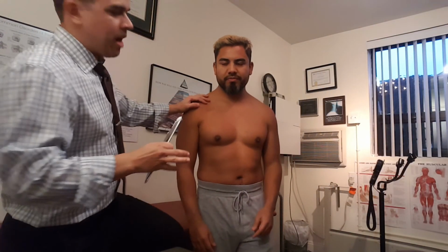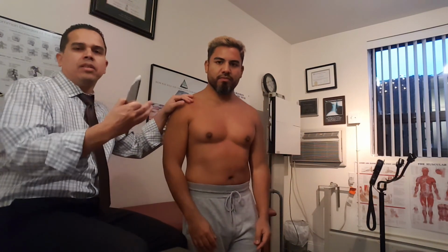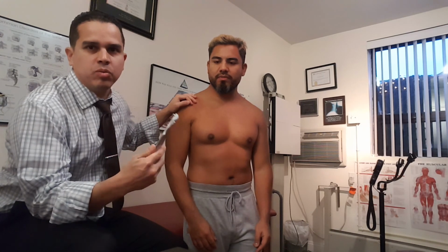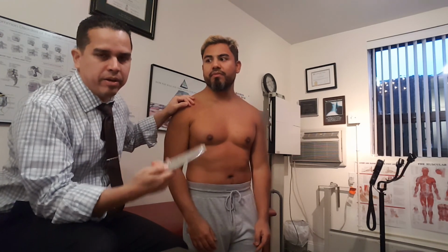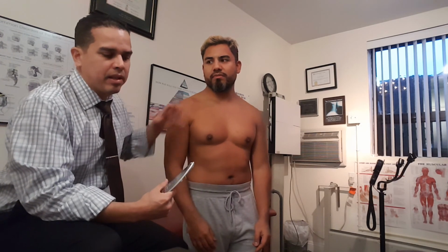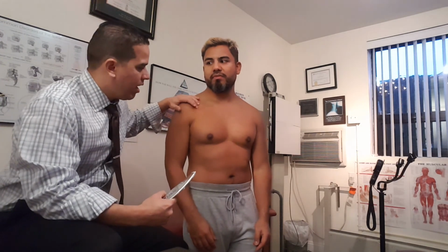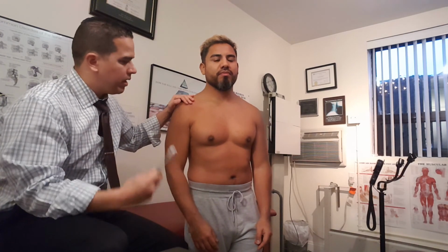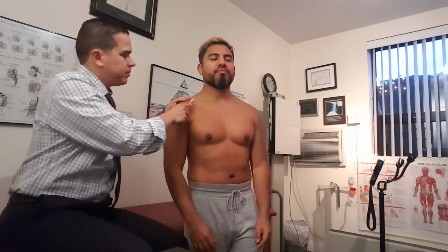So today we're going to do a combination of our instrument-assisted soft tissue. There's different techniques. One of the famous ones, Graston technique, my colleague's technique. And this is basically, we're going to take his tendon, bring it through motion, and work on it. That way he regains his capacity.